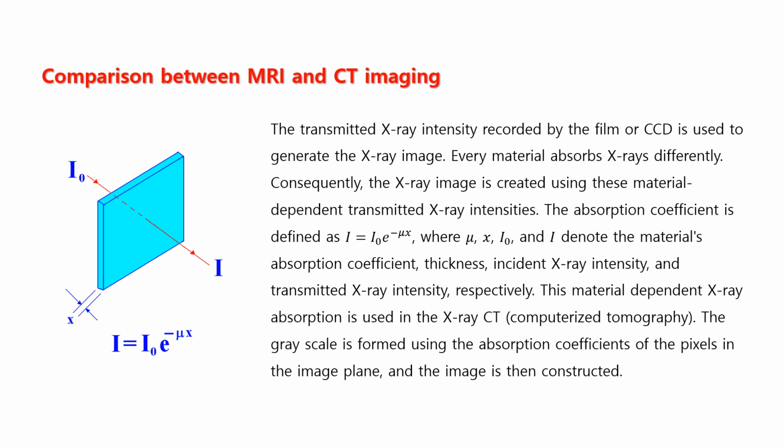Now let's compare the data taking process between MRI and CT imaging. The data taking process in these two imaging machines is nearly the same. So we can see what kind of techniques are used in CT imaging.